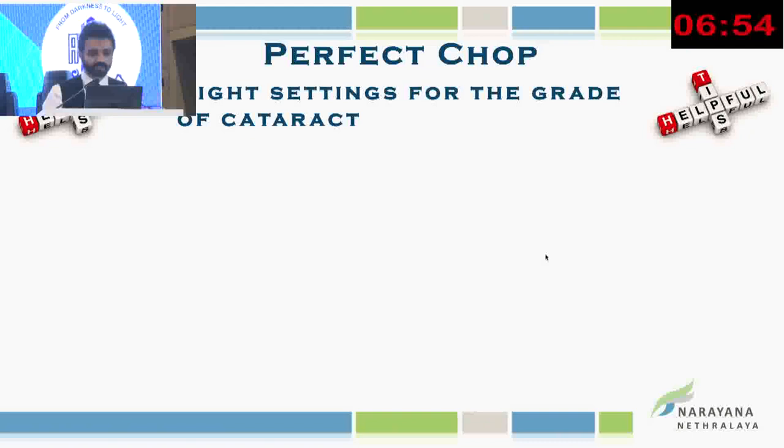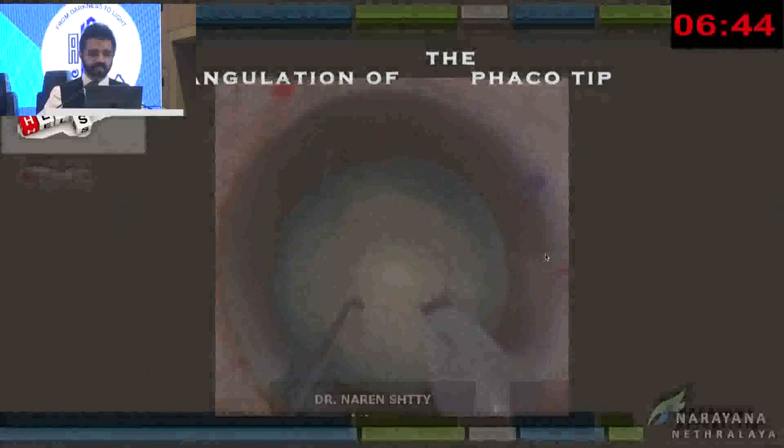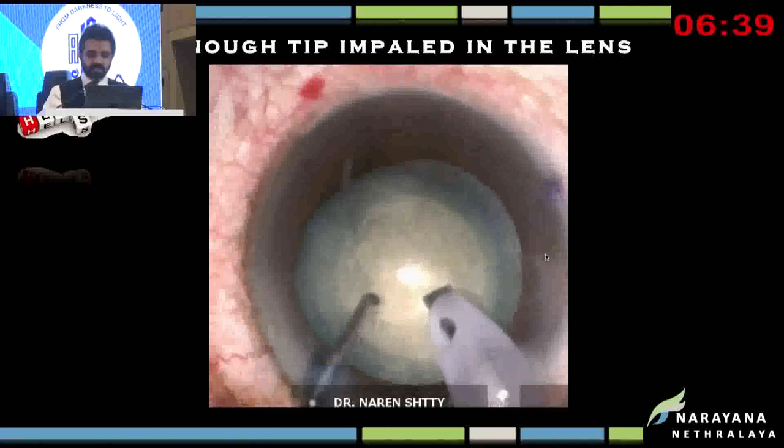But in terms of technique, the angulation is very important. Initially, when you angulate the tip onto the lens, always have a 45 degree angle. The next thing is impaling the tip into the lens. See, if you observe here, I make sure the tip completely disappears into the lens before I initiate my chop.